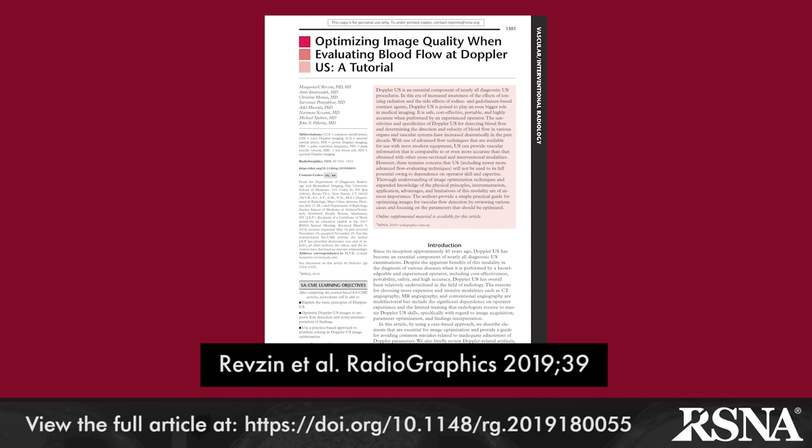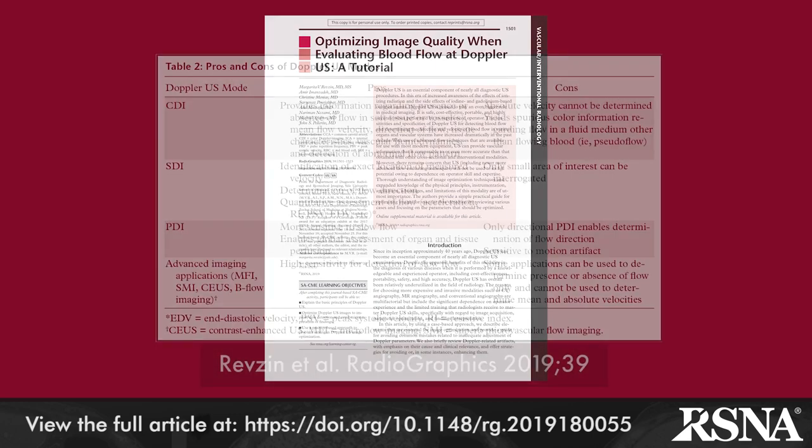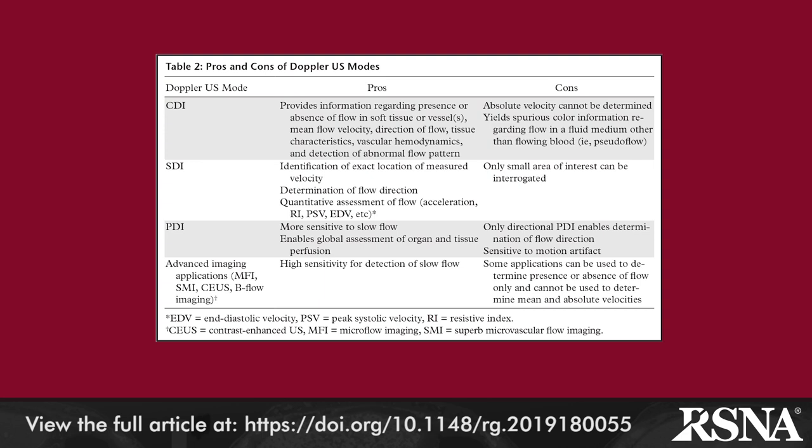The three acquisition modes utilized in Doppler ultrasound imaging include color, spectral, and power Doppler imaging. Table 2 reviews the advantages and limitations of each. Color Doppler allows for simultaneous grayscale imaging and assessment of vascular hemodynamics, while spectral Doppler provides quantitative measurement of the velocities of flow within a sample volume. Power Doppler provides the strength or amplitude of the Doppler signal, is more sensitive to low flow states, and allows for global organ or tissue assessment.